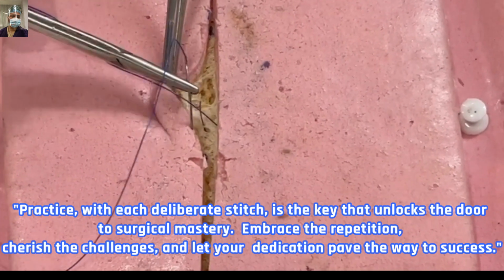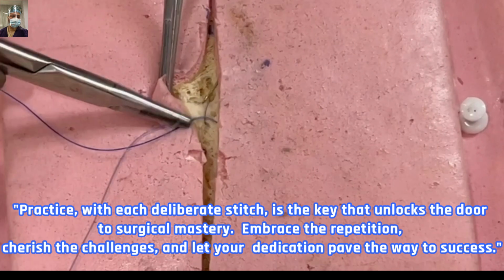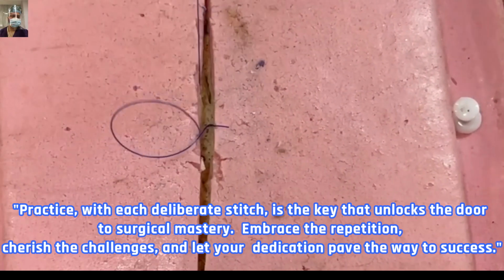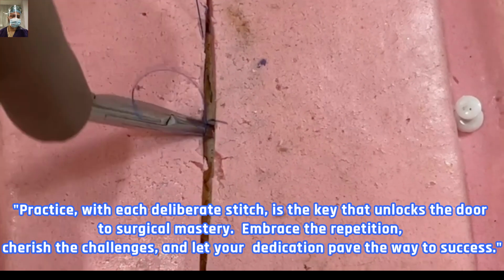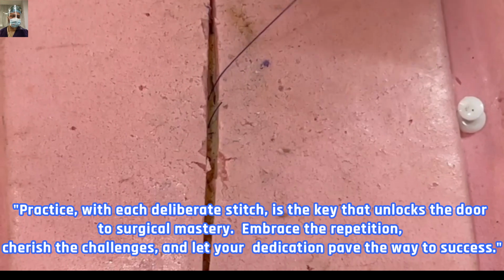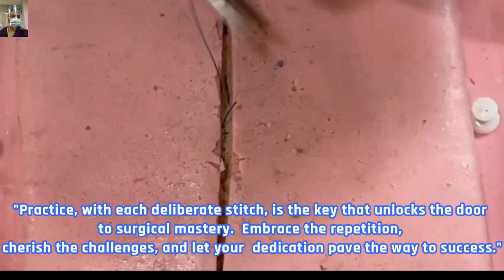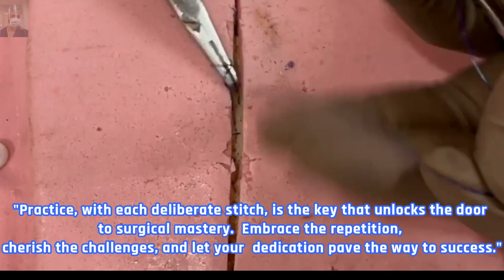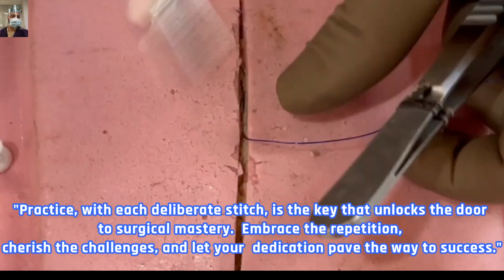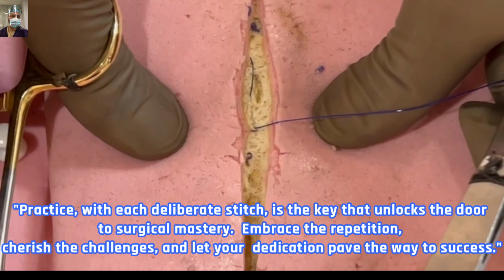So we start from the opposite side. In all the suturing techniques, I started on the same side, from the right side. Here I started from the opposite side, so that my end is down. Then I come to the other side, so both the needle ends are looking downwards.